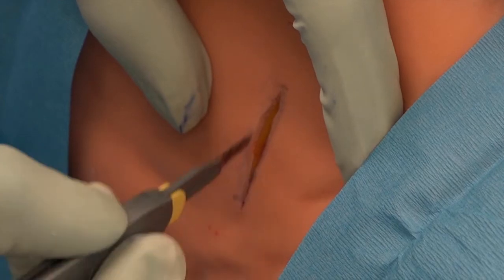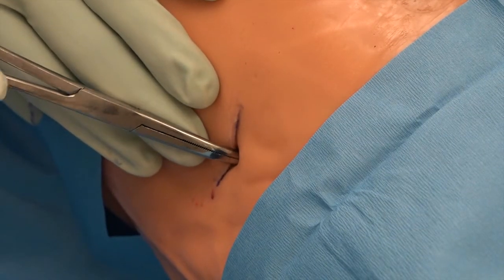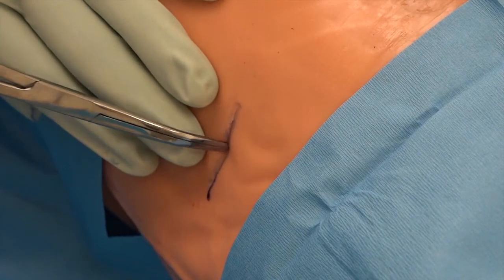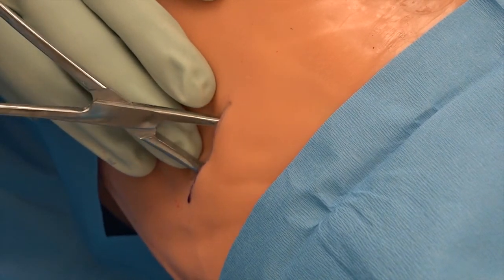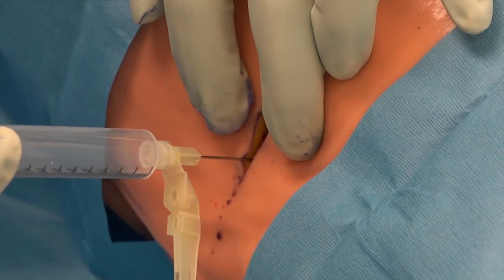Using the skin mark as a guide, make an adequate incision. Utilize blunt tissue spreading technique to dissect through the subcutaneous tissue down to the intercostal muscles. At this point, inject additional lidocaine to block the intercostal nerve.